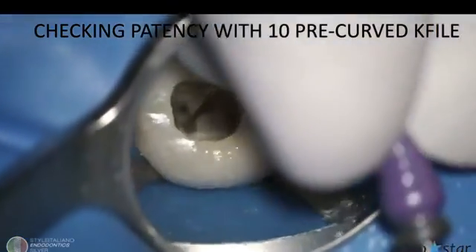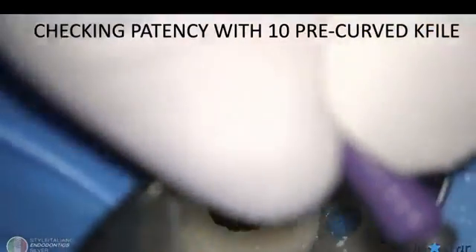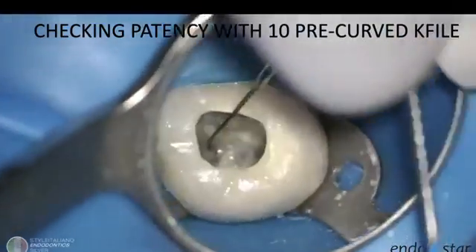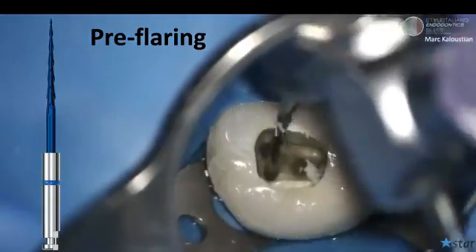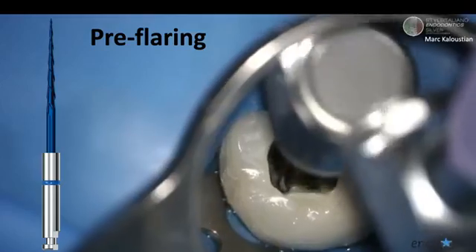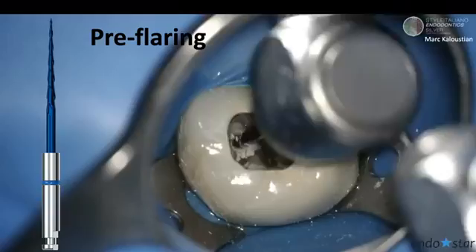And after removing the material with a pre-bent number 10 file, I don't know if you are seeing the video here, I am using the pre-bent number 10 file to go inside the canal. I pre-curve it and I try to reach the patency. And it is very important here, especially in the mesial root of the tooth. Now I can add more pre-flaring after doing the patency test, because I want to have a nice access to the apical part in these canals.